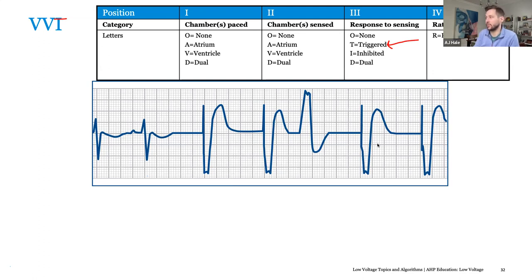I think that those are all really good points. What you could do, I don't know if you have access to echo, but you could assess cardiac output under pacing at a higher rate versus under their intrinsic. And if their intrinsic is really that terrible, then I think you're better off pacing at a higher rate, but I'm not a physician either.